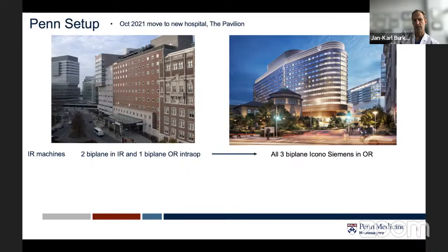And if you think about all the other stakeholders involved in cases, a lot of things change. Anesthesia, for example, was present for all our treatment cases before, but for diagnostic angiograms we usually did nursing sedation, not necessarily anesthesia. Now all the cases are in the intraoperative setting, so anesthesia is there for every case, for every diagnostic angiogram. They are doing the MAC sedation for the patients. That's a big change.